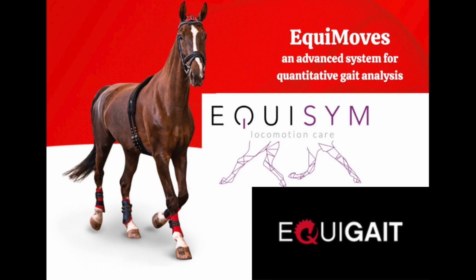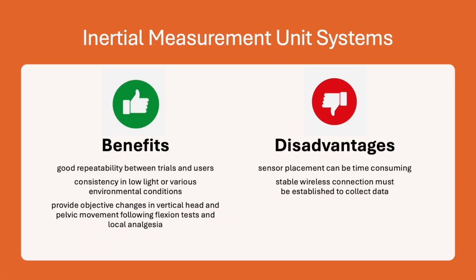The Equimove system is an example of a more comprehensive system that uses an 8-sensor setup. Other systems include Equigait and Equisim, which can use 3 to 8 sensors or 3 to 7 sensors, respectively, depending on the type of assessment being performed, and the XSens, which uses 6 sensors.